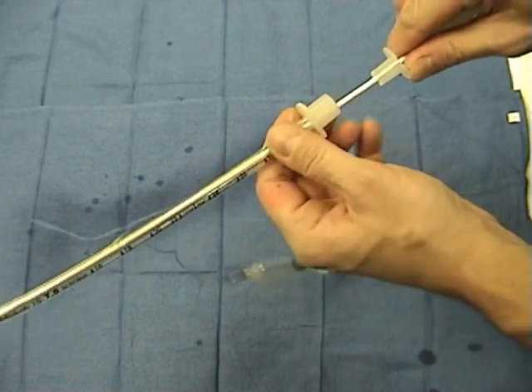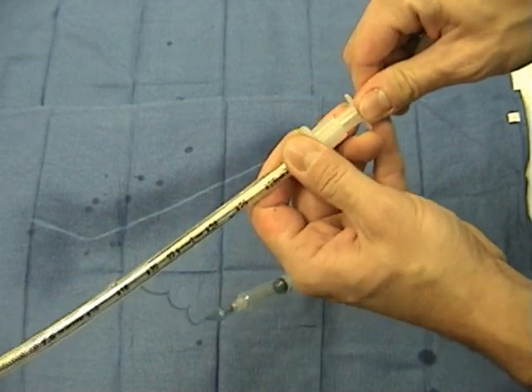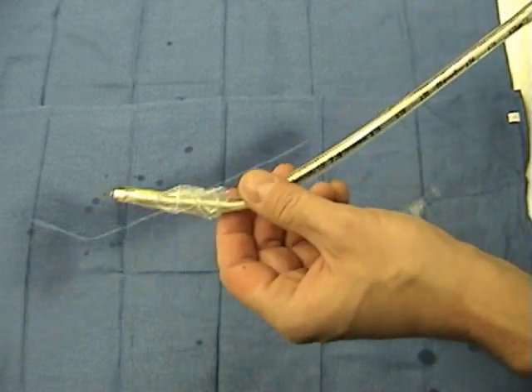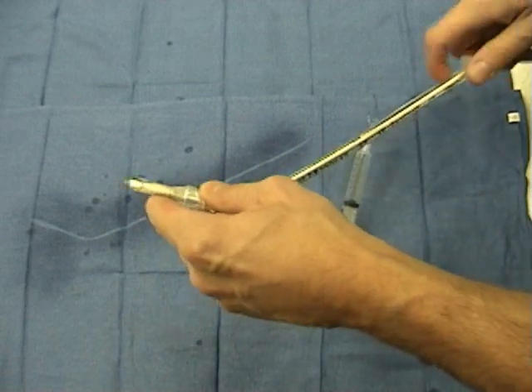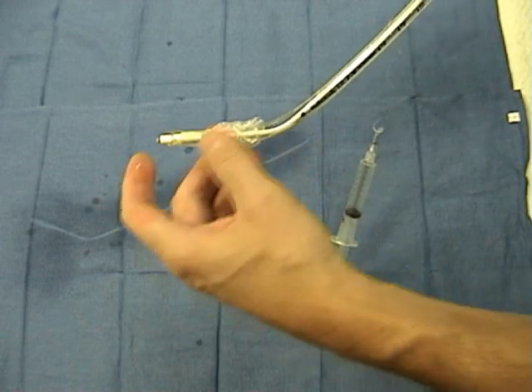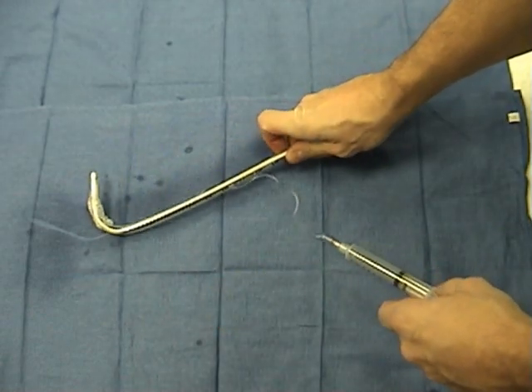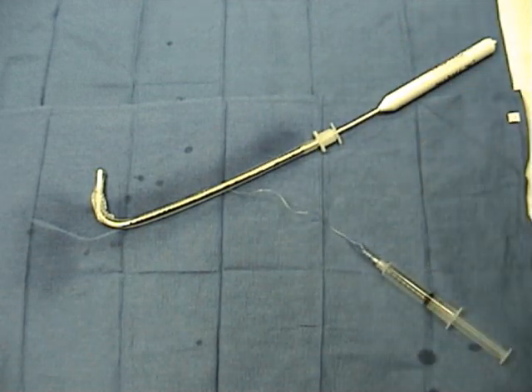We have to make sure to secure the most proximal portion of the endotracheal tube to the lighted wand to prevent it from being pushed in or withdrawn too far, which keeps the stylet more stable. The final issue is to do the appropriate bend of the end of the wand — approximately five to six centimeters of the stylet should be bent to 110 degrees or so to allow an easier introduction.